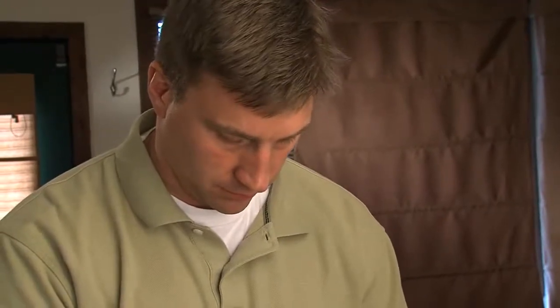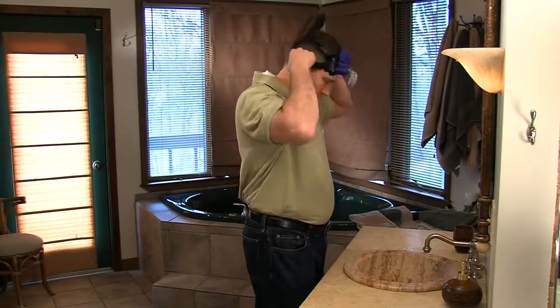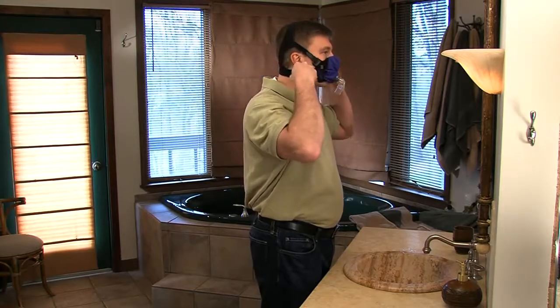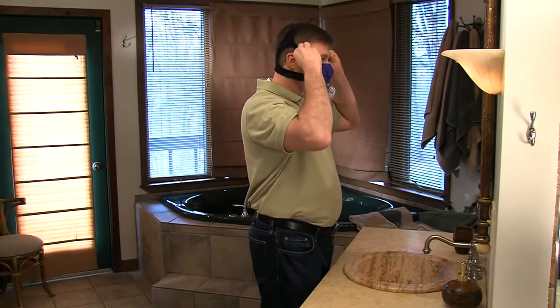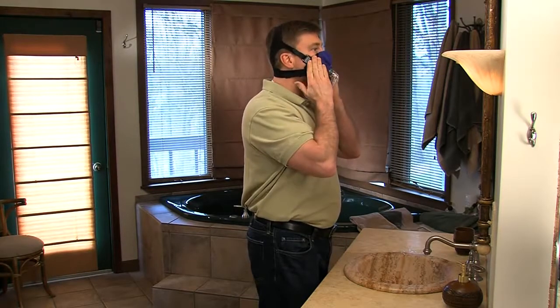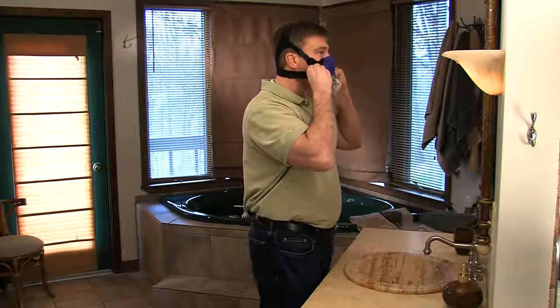Hold the mask and headgear with the bottom of the mask facing you. The label is located on the outside back of the headgear. Pull the headgear over your head so that the neck support of the headgear rests comfortably on your neck. Important: do not over-tighten the straps. Start with the straps loose and then tighten as necessary to achieve an airtight seal.